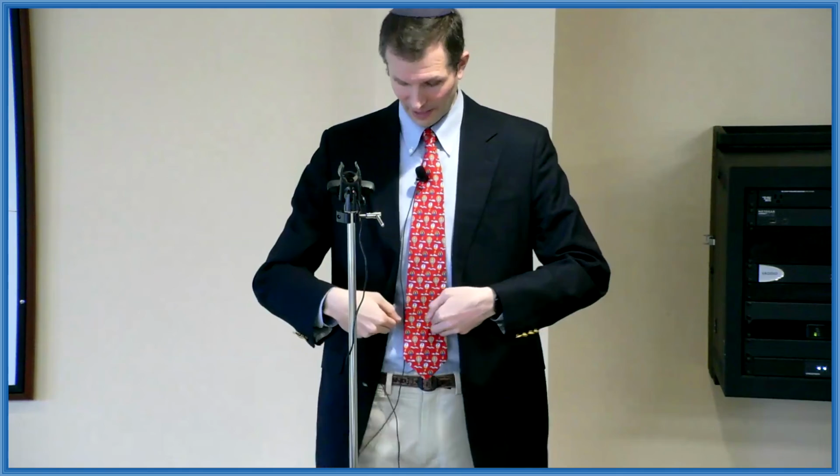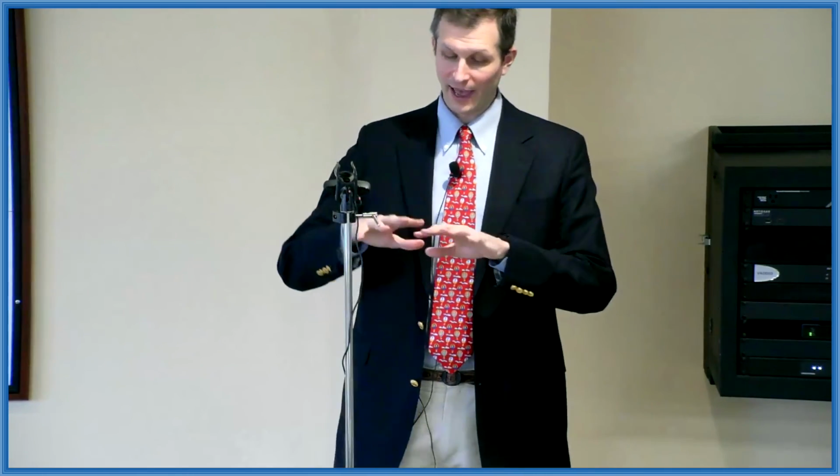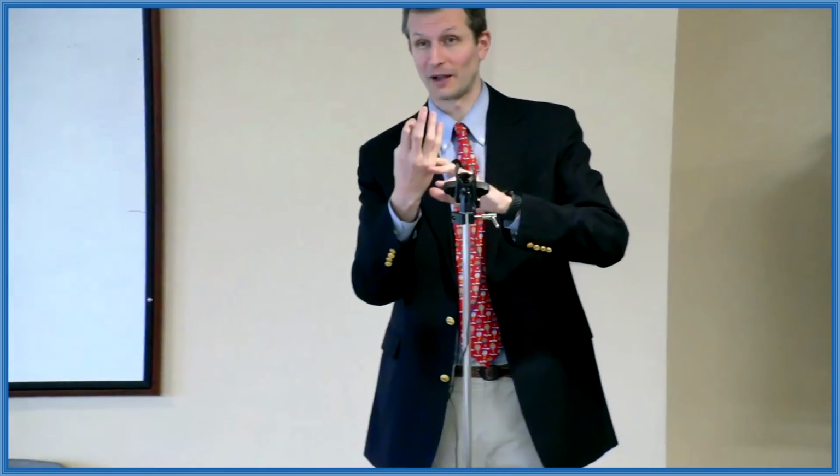Now, this is not something I showed today, but just as we can put a plug in the left atrial appendage to prevent stroke from AFib, if people can't take blood thinners, we can put a filter in the inferior vena cava, in the main vein coming from the legs, and that filter has a meshwork to prevent clots from coming up. So for people who can't take blood thinners, there are therapies as well to prevent clot from the legs from reaching the lungs, but it's a different therapy.